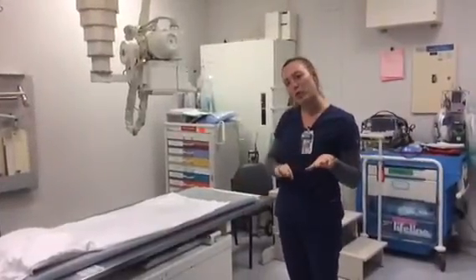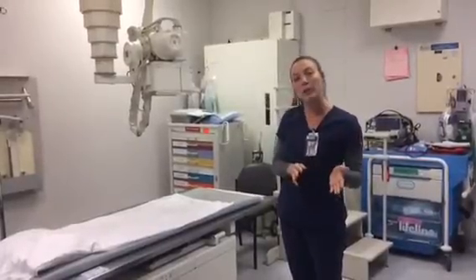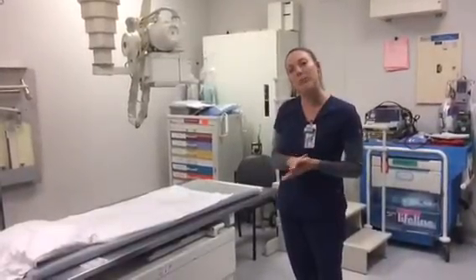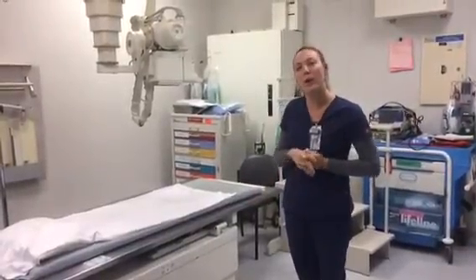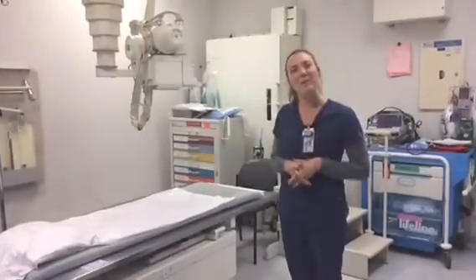Also, for all three projections, we'll be using a 5-degree cephalic tube angle. According to Merrill's, this tube angle will change, especially for the AP projection of the knee, depending on the measurement of the patient's ASIS to the tabletop. However, at this clinical site, we do a 5-degree cephalic tube angle for all three projections. Now that the room is set up, we'll go get our patient.